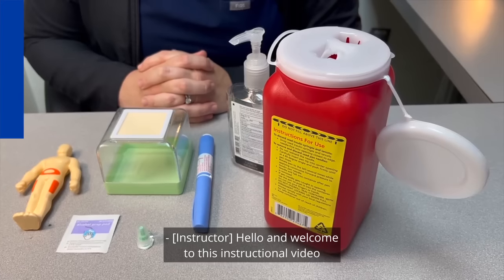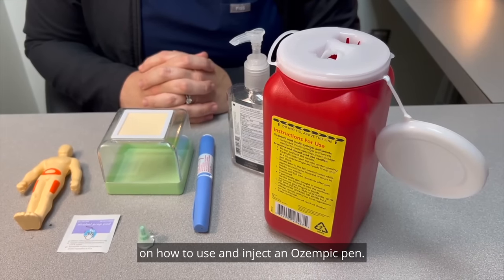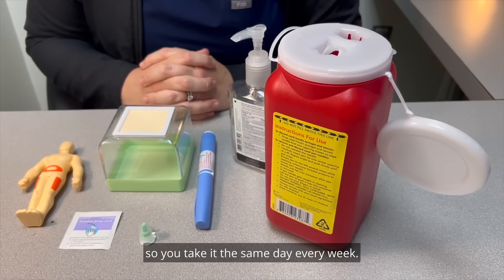Hello, and welcome to this instructional video on how to use and inject an Ozempic pen. Ozempic is taken once a week, so mark your calendar so you take it the same day every week.